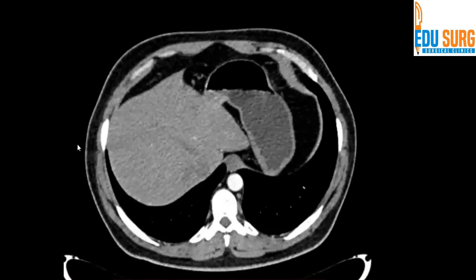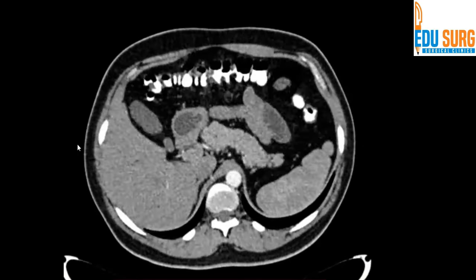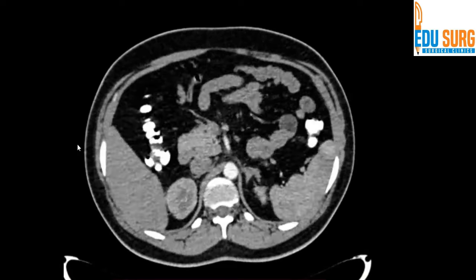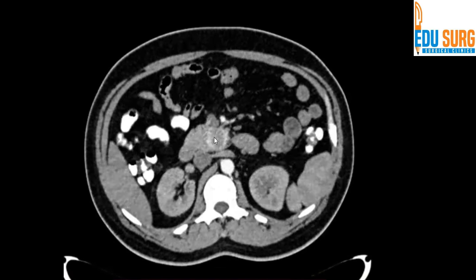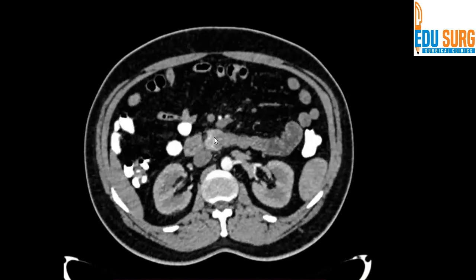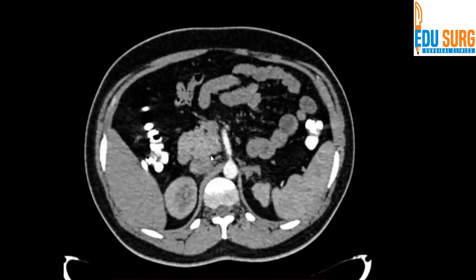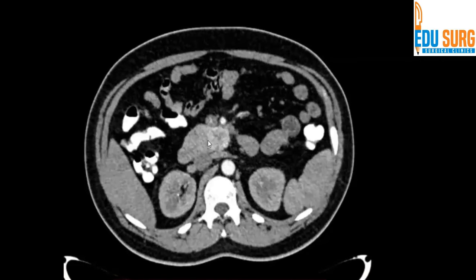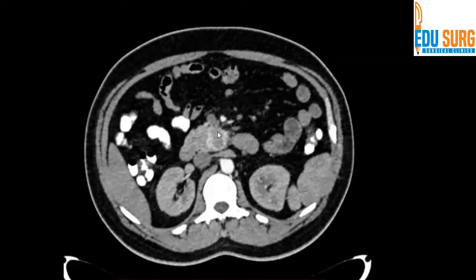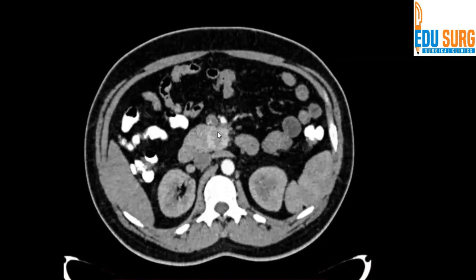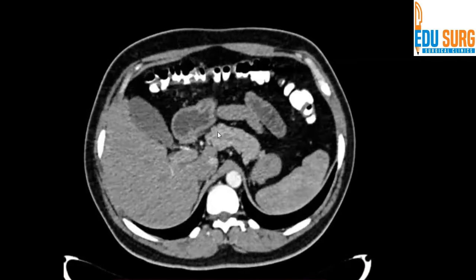Let us see what you may have missed and what you may have identified very easily. I am sure most of you have identified that there is an arterially enhancing lesion, probably in the uncinate process. This is the pancreas — so probably in the uncinate process, or it is a lymph node in that area. I am saying it could be a lymph node because of one other finding that can probably be missed if the scan is not seen properly.